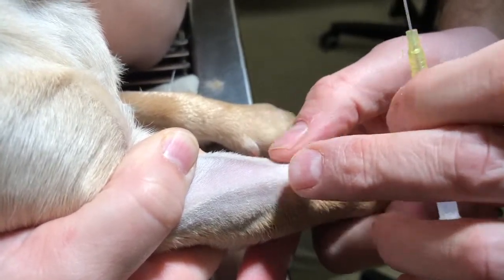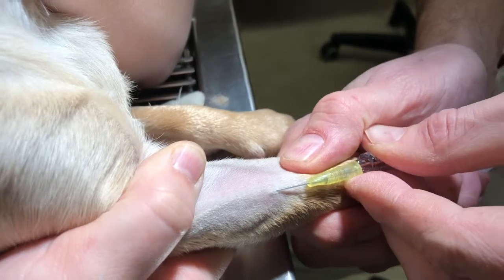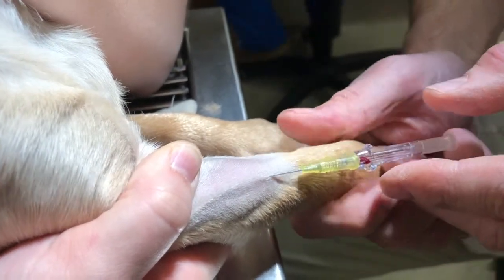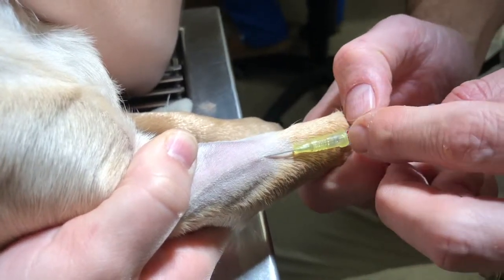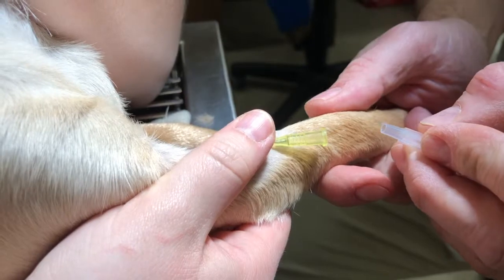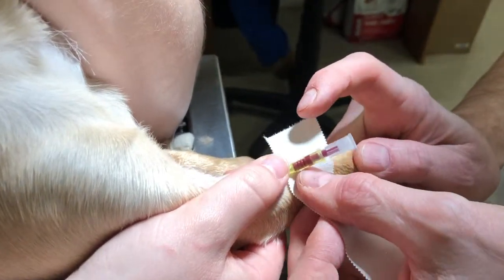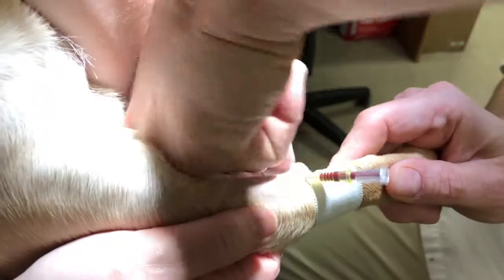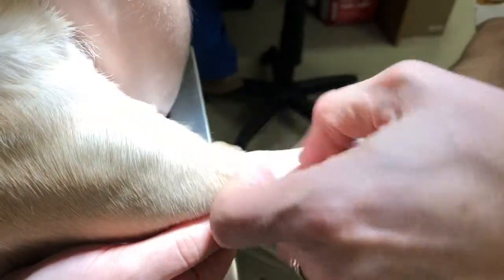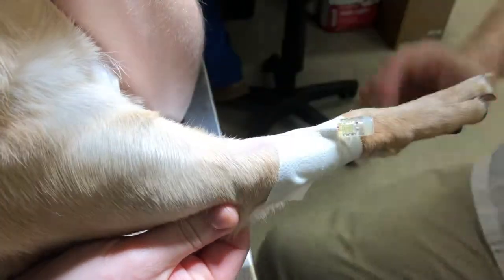Here's the vein — you see it? Is it bouncing? Right there. A little flash — I went too far. I'm going to pull back just a hair. It's not bleeding well, but this is a small-gauge catheter, so we've got some blood coming. I think we're there. I'm going to try to work it up. Put that up and see if we're in there. Good. Same tape over again — I just do it the same way every time so my fingers get good at it. Done. That's three examples.